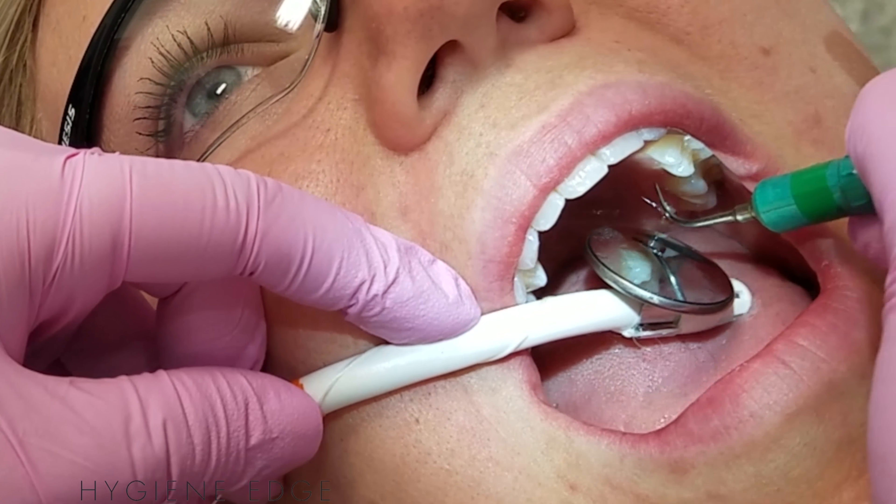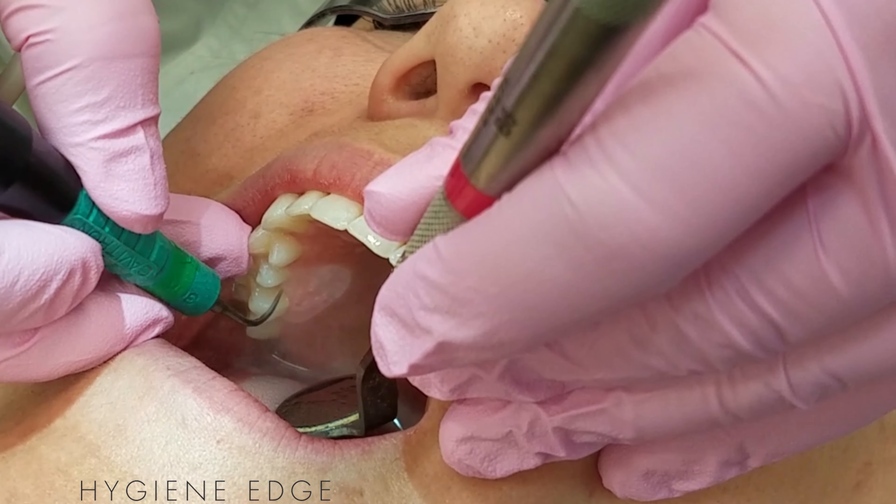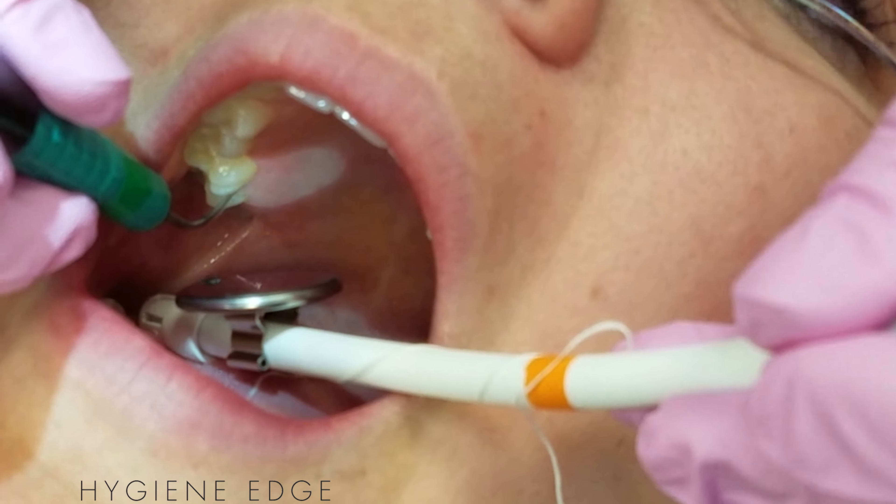The manufacturer recommends the use of the Blue Boa DE, which holds a standard saliva ejector to reduce aerosols, increase suction, and reduce hand fatigue.